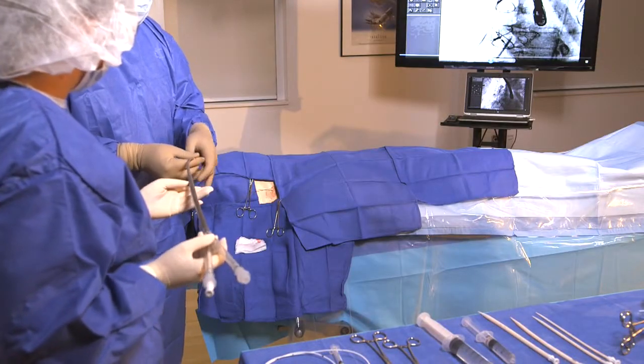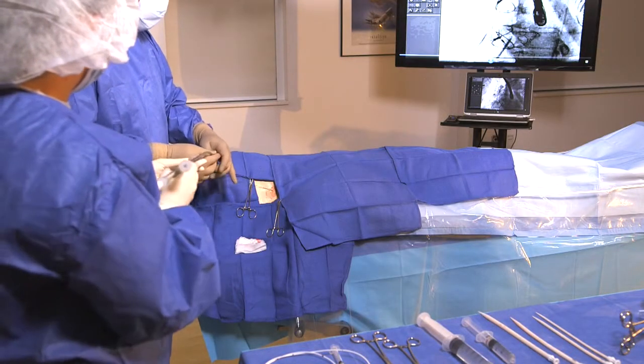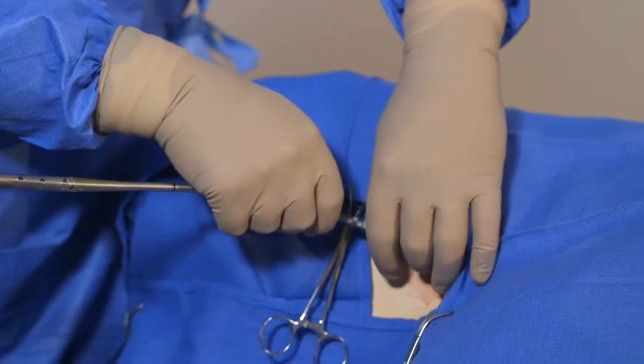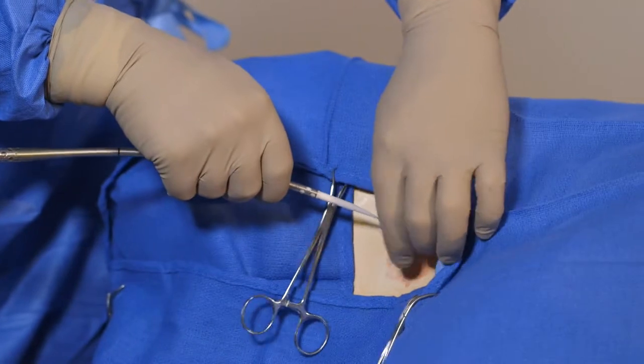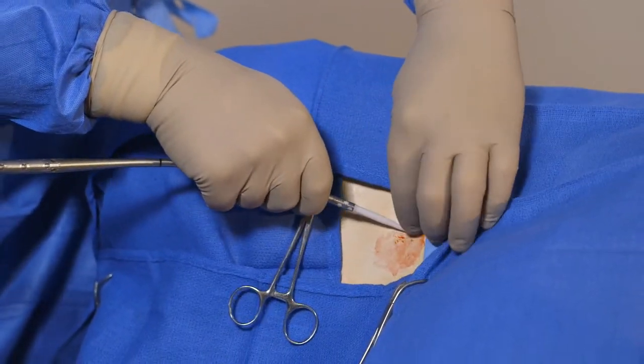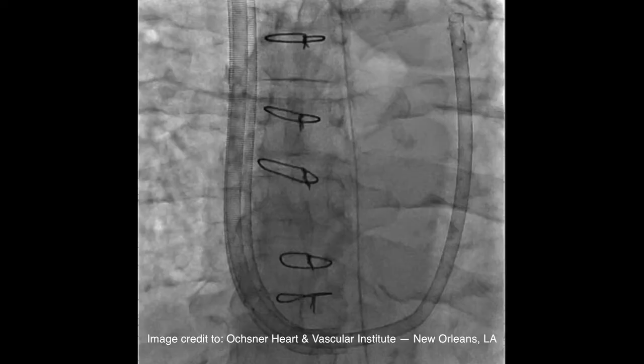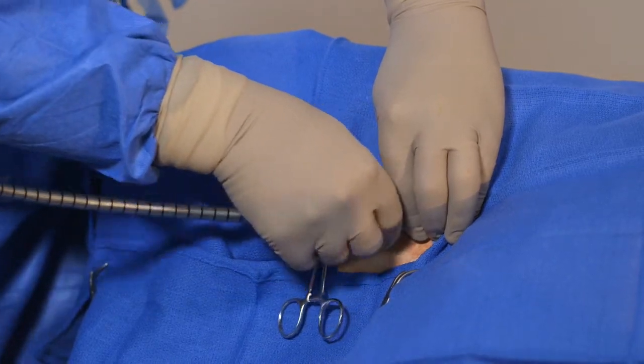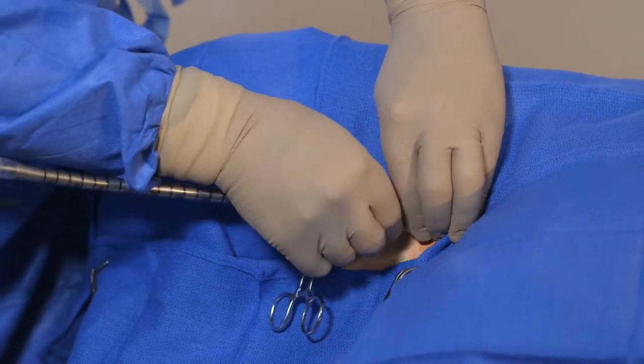Insert the introducer cannula assembly over the guide wire and advance to the desired location. Confirm the position of the tip of the PROTEC DUO cannula via pressure transducing, saturation sample, and/or echocardiography. Confirm that adequate volume exists via right heart pressures.